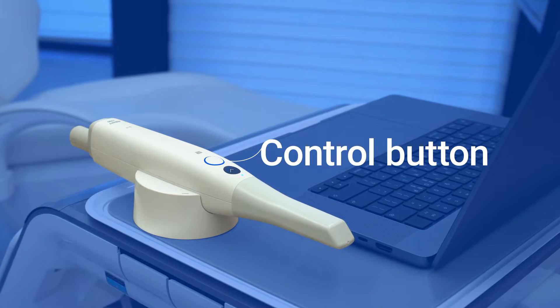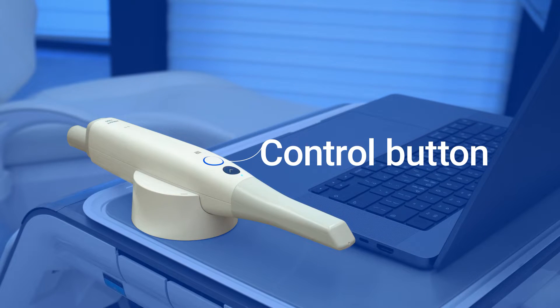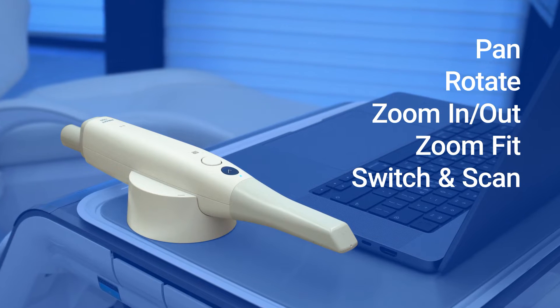This is a quick guide on how to use the control button of the scanner. You can use various functions with this control button.